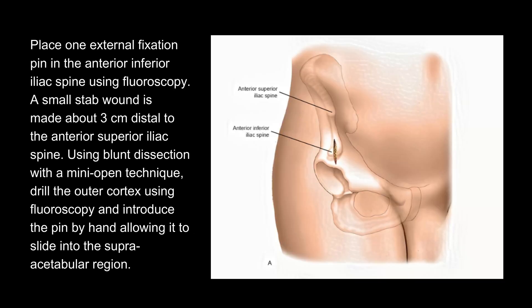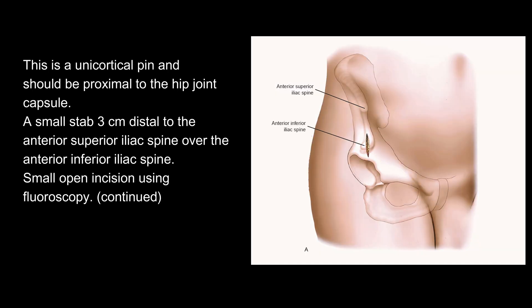Place one external fixation pin in the anterior inferior iliac spine using fluoroscopy. A small stab wound is made about 3 cm distal to the anterior superior iliac spine. Using blunt dissection with a mini-open technique, drill the outer cortex using fluoroscopy and introduce the pin by hand, allowing it to slide into the supra-acetabulum region. This is a unicortical pin and should be proximal to the hip joint capsule.